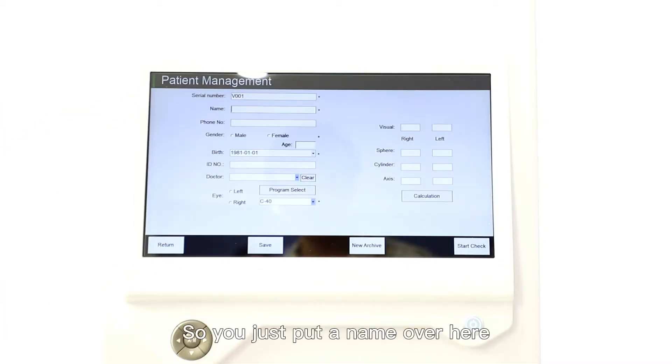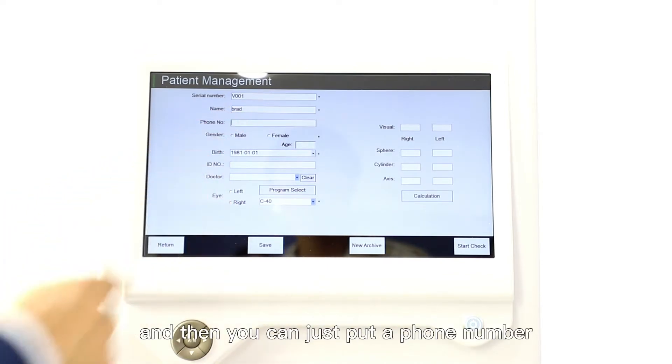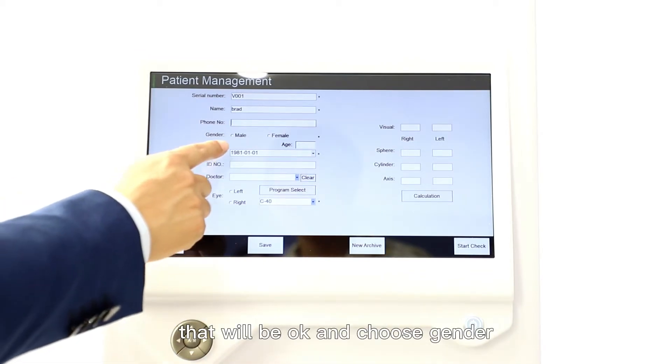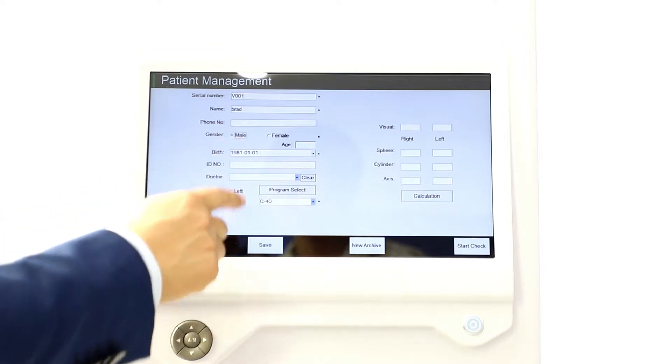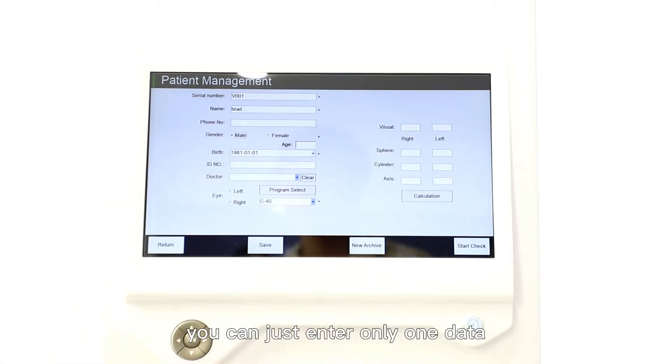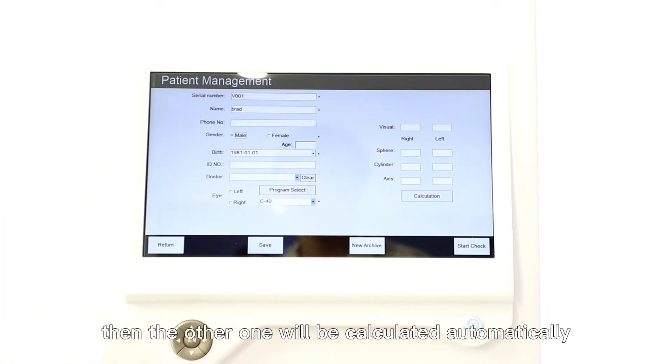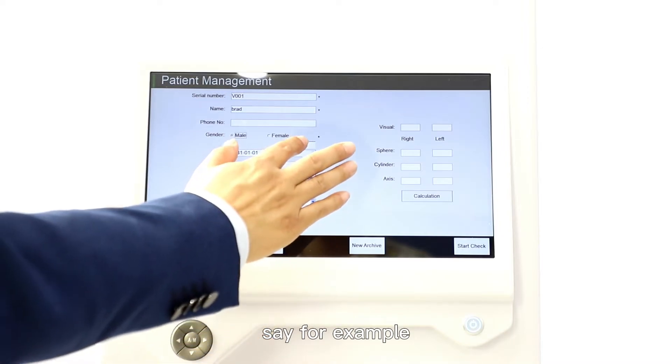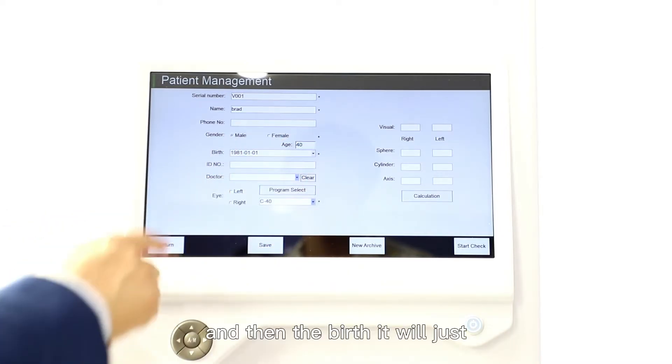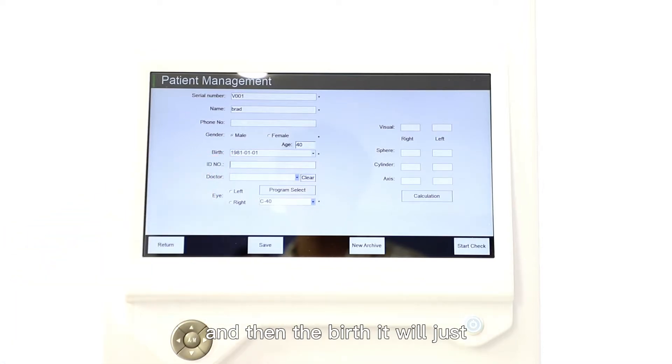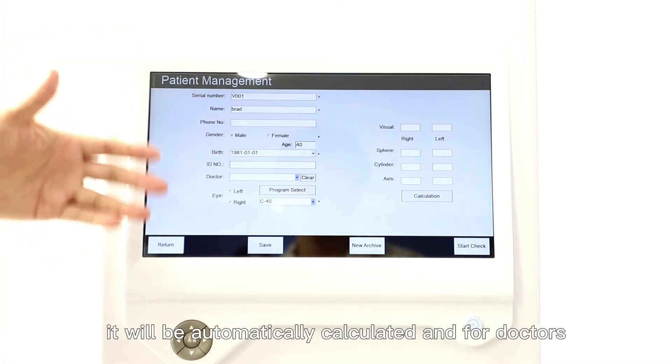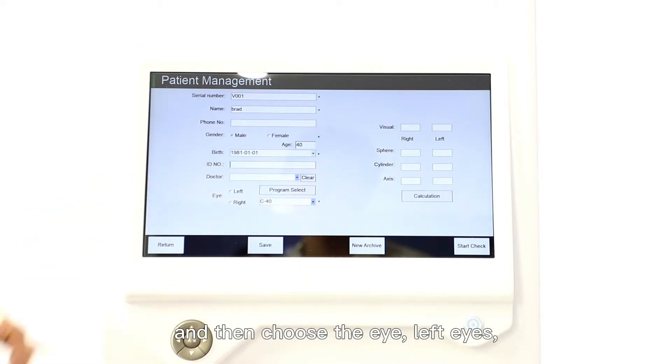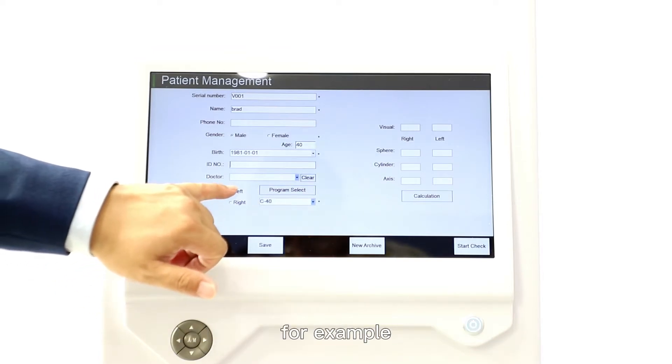You just put a name over here, my name is Brad. You can put a phone number, your own phone number, and choose gender. For age and birth, you can enter only one data then the other one will be calculated automatically. For example, age is like 40, and then the birth will be automatically calculated. For doctor, you can choose any doctor name that you want to put in, and then choose the eye, left eye for example.